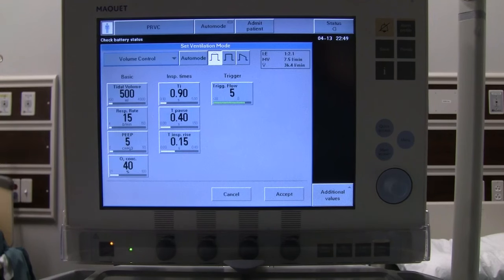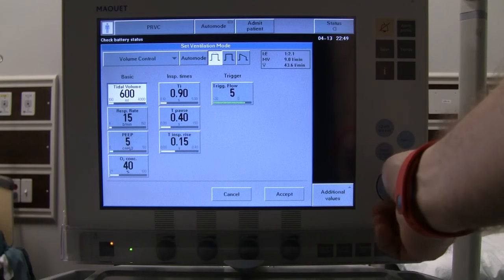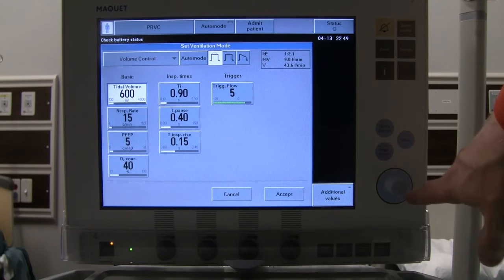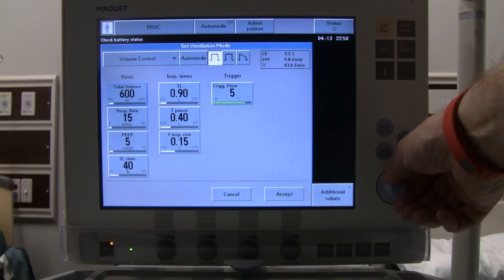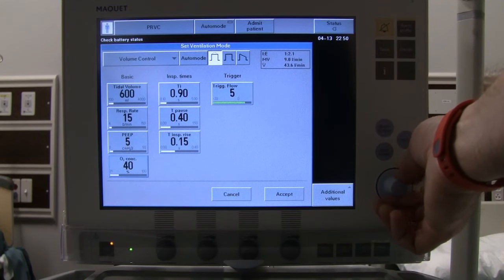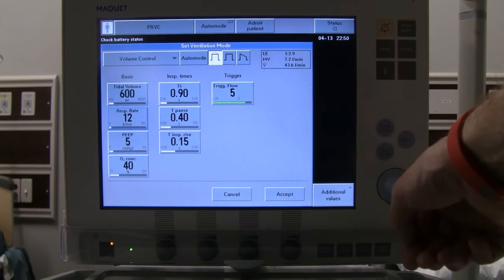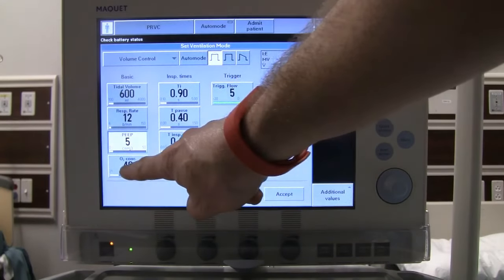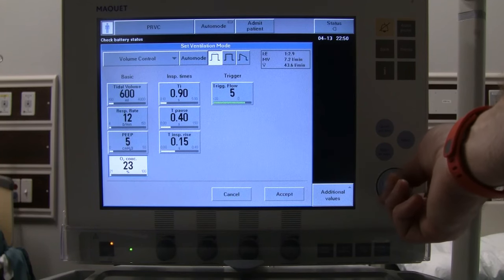In volume control we have several familiar settings. We'll start with tidal volume, configured based on patient size — let's assume we want 600 mL tidal volume. You can use the knob to make adjustments and push to select. We also have respiratory rate — let's set it at 12 — and PEEP, FiO2, and O2 concentration. We'll turn FiO2 down to 21%.